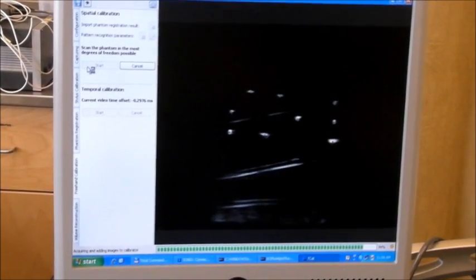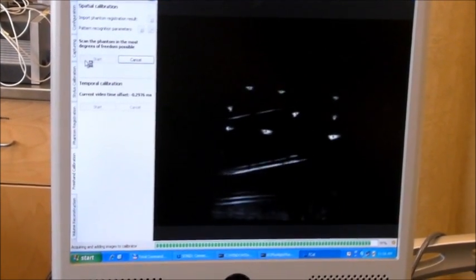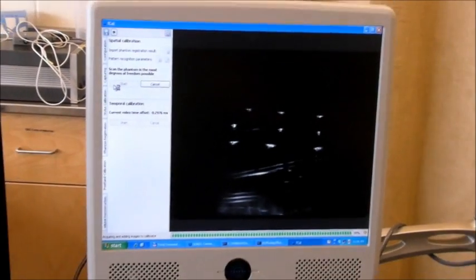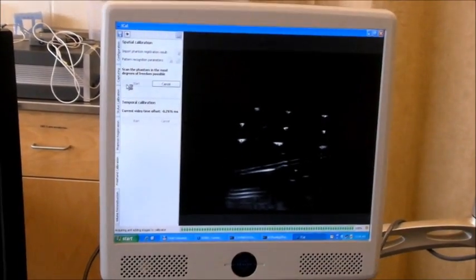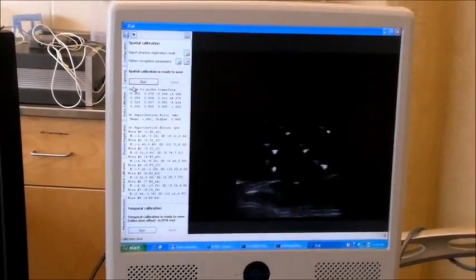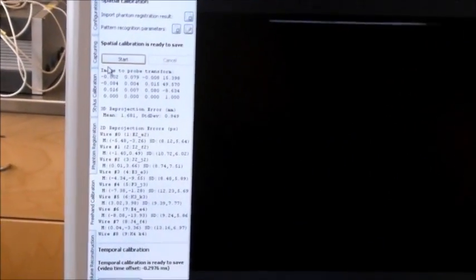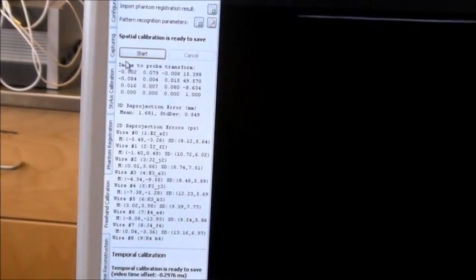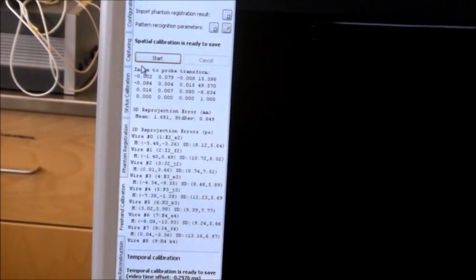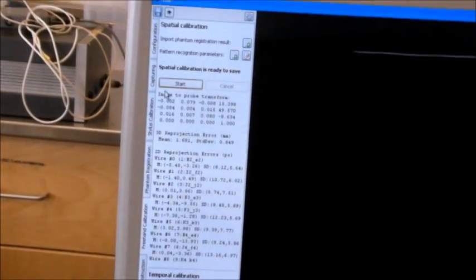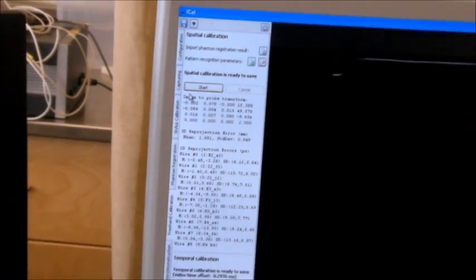Almost done. Yes, we calibrated the probe.